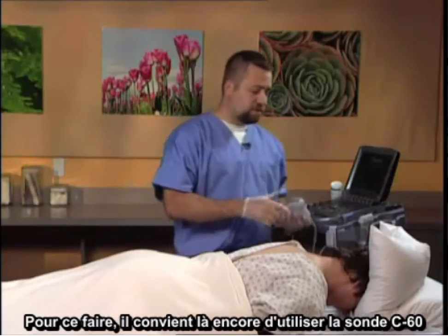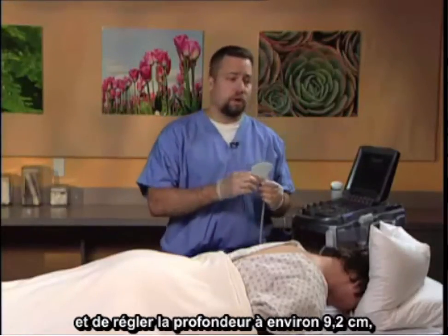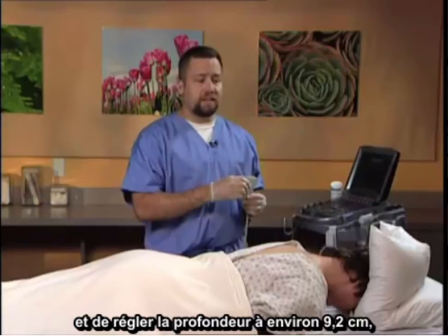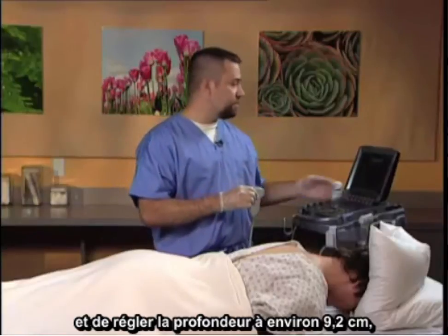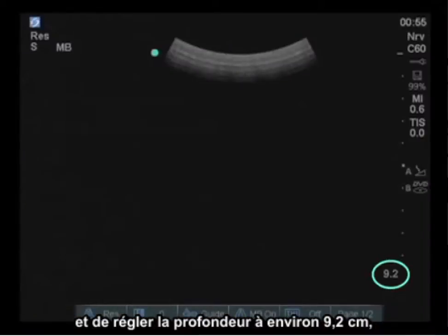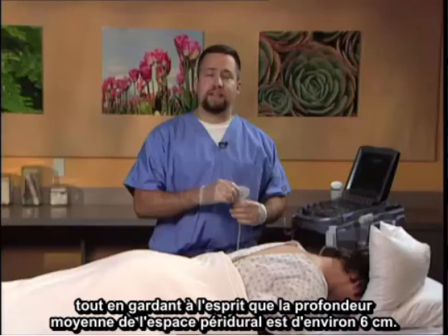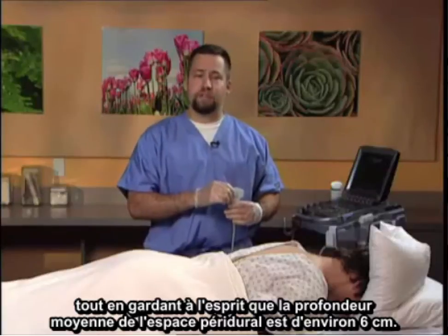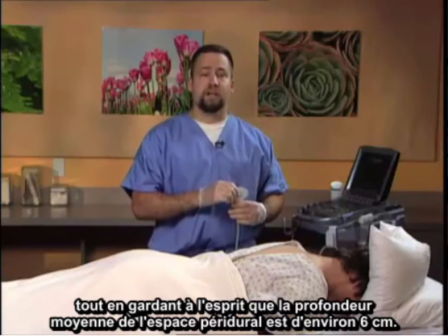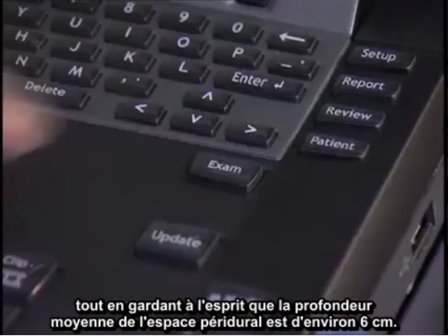This is performed utilizing the C60 probe, setting the depth to approximately 9.2 centimeters, remembering that the average depth to the epidural space is approximately 6 centimeters.